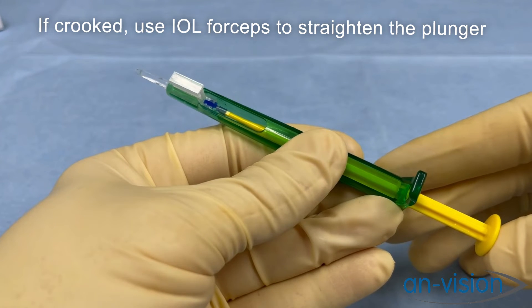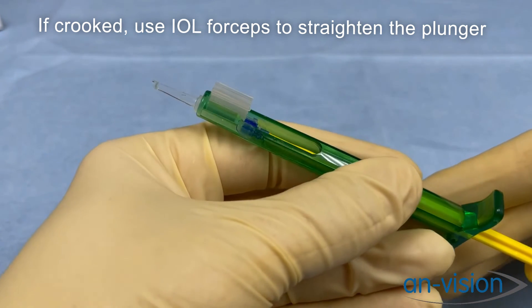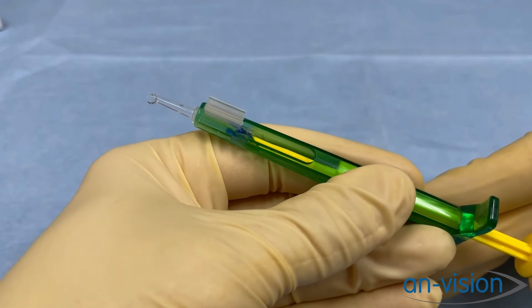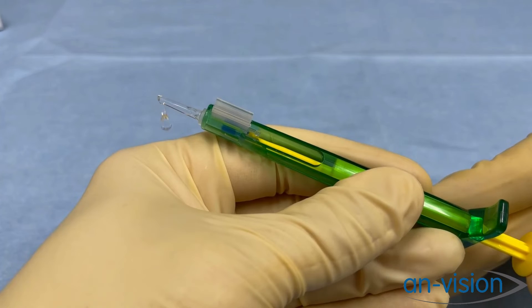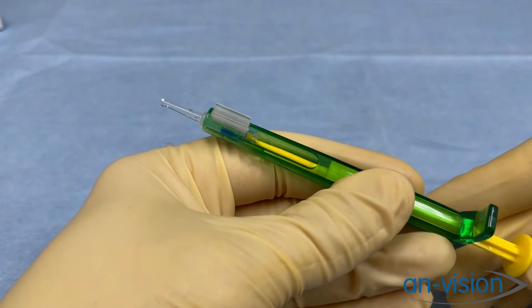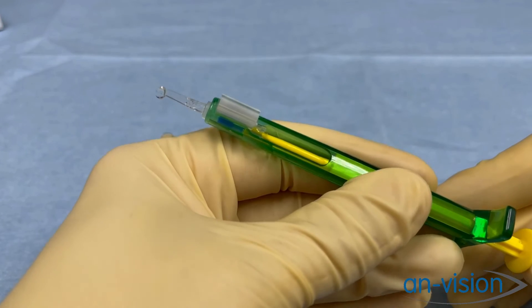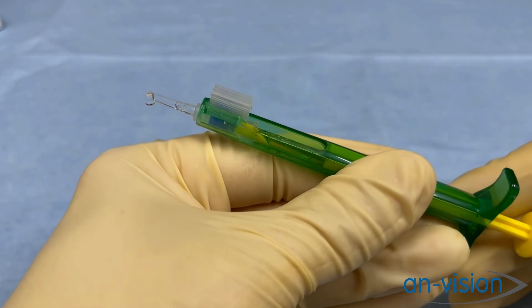Now, we are going to push that IOL into the loading tube, this front part, until it is about halfway into that tube. As you can see, you can see it entering.